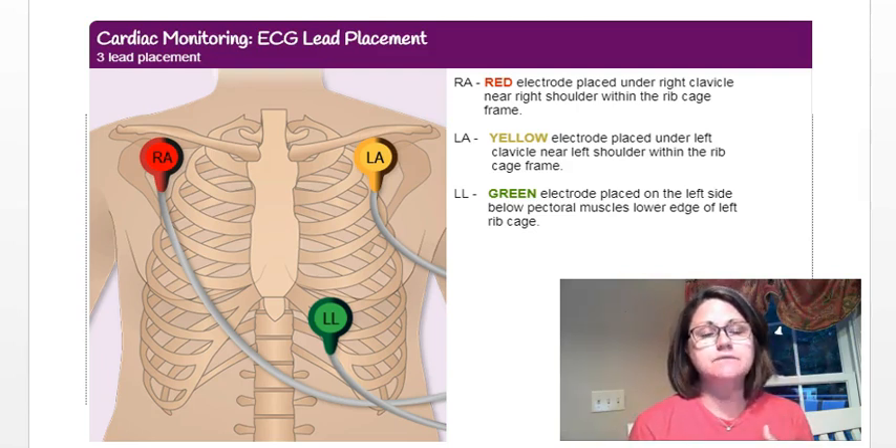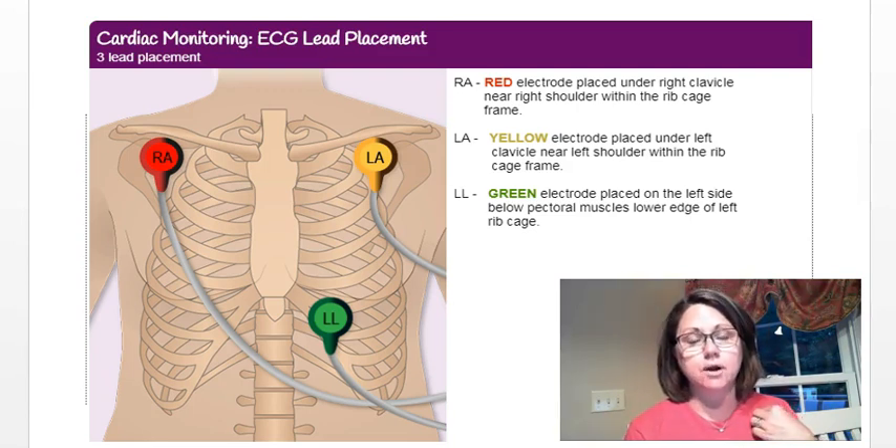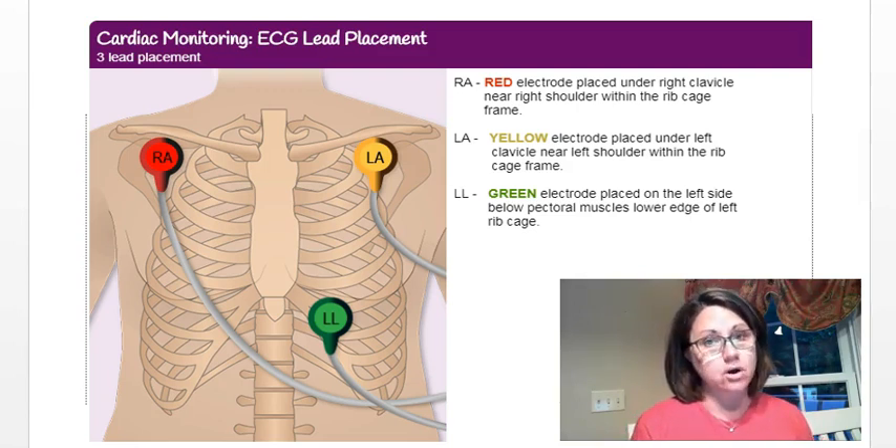If they're not red, yellow, and green, they may have writing on them. In this picture you can see RA on the red one, LA on the yellow one, and LL on the green one. RA stands for right arm, LA stands for left arm, and LL stands for left leg.